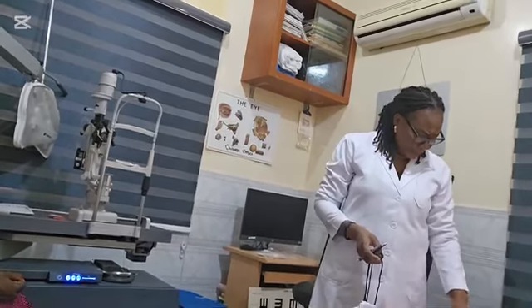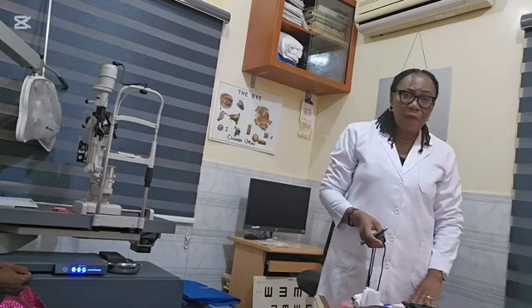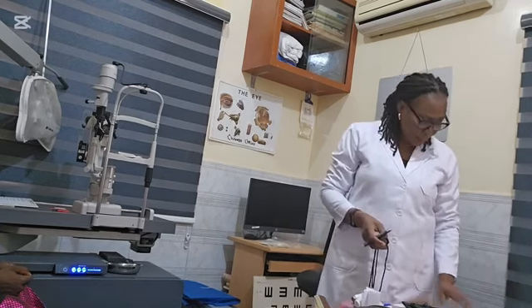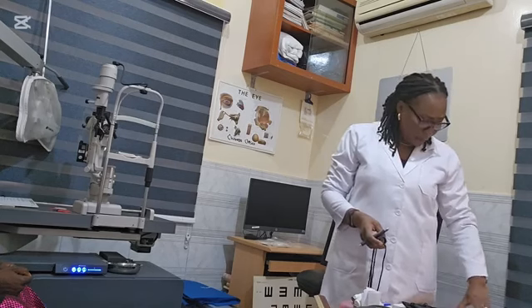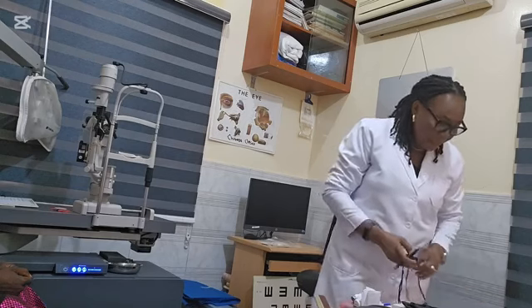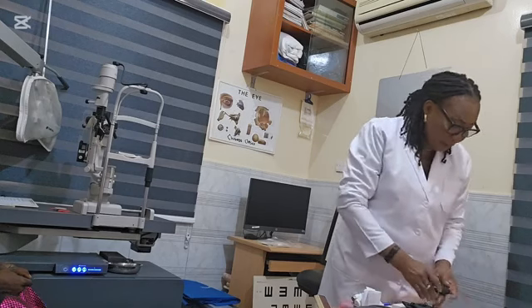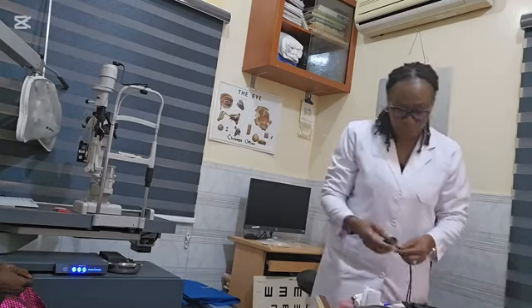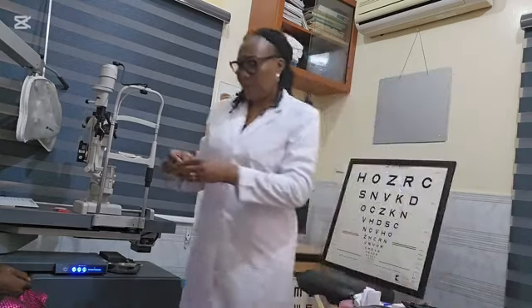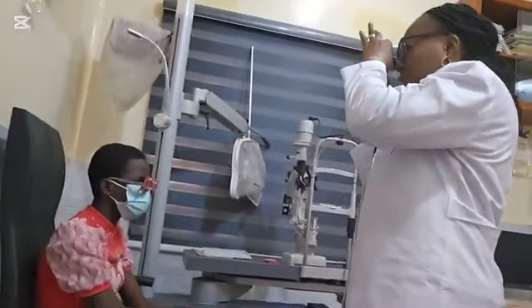So to get the power magnification at distance, that's the power for the telescope, we'll use the formula to calculate it, and the calculated magnification is 5x. So we are going to try a 5x monocular telescope here. What I'm doing is adjusting it for her.